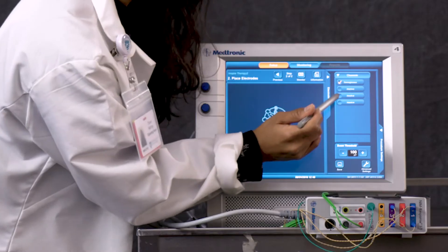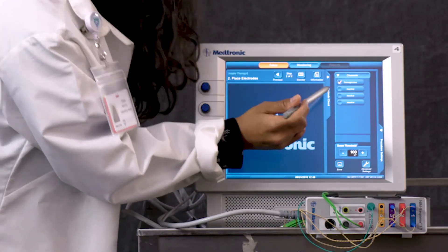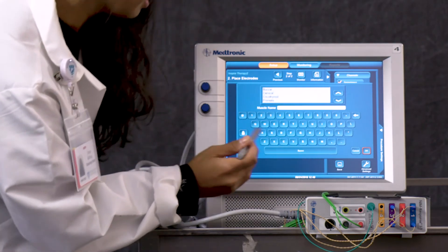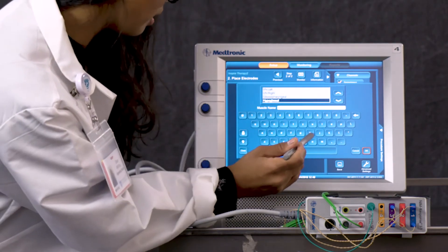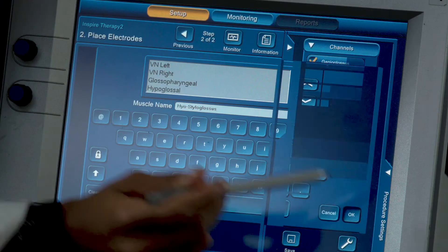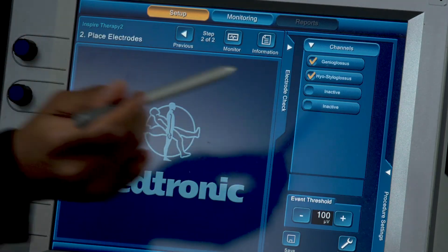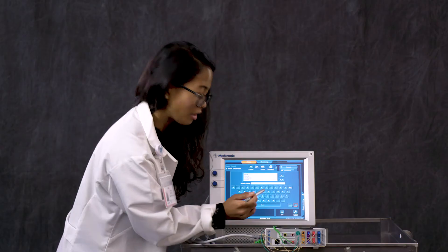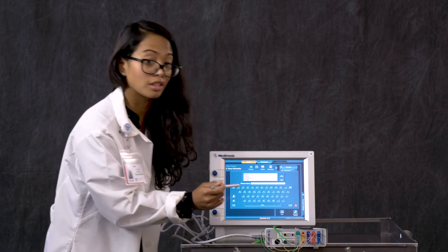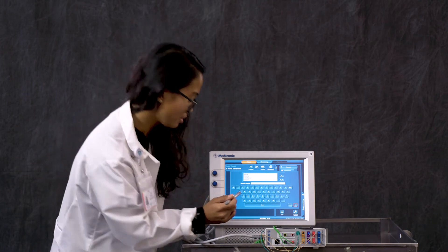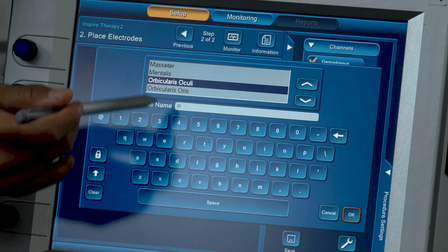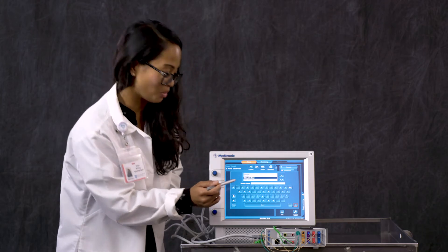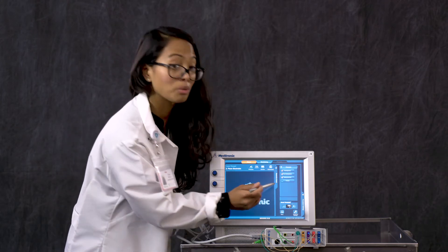Now we're going to do channel 2. Again, I deactivated it and I'm going to create a second channel. This one we are going to call hyostyloglossus. Press OK. Moving along. And now our third channel, which we are going to call orbicularis oris, or the upper lip. Sometimes you'll get options and it makes life easier where you can just pick. Here we have our three channels.